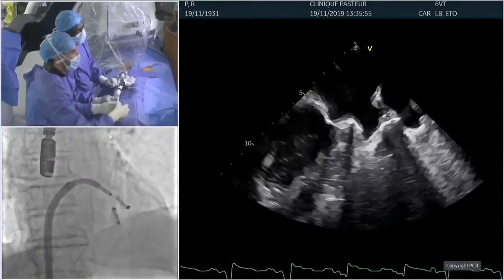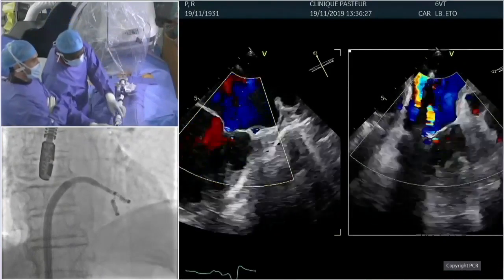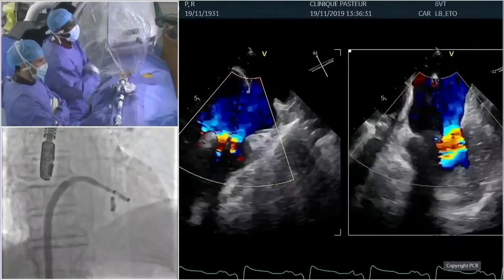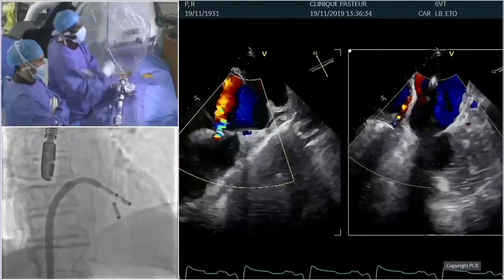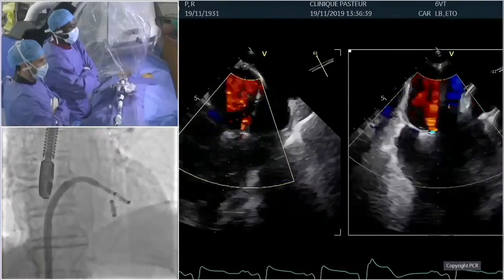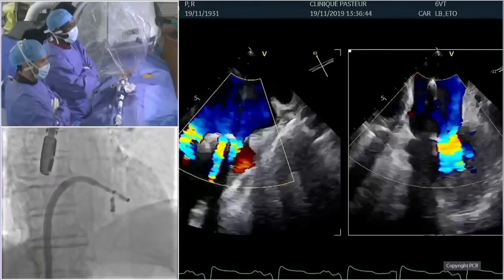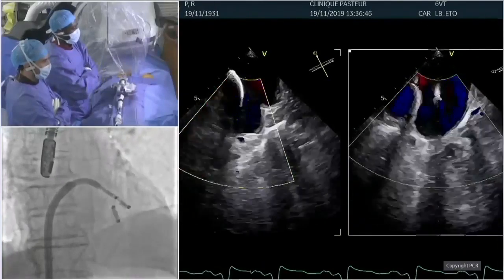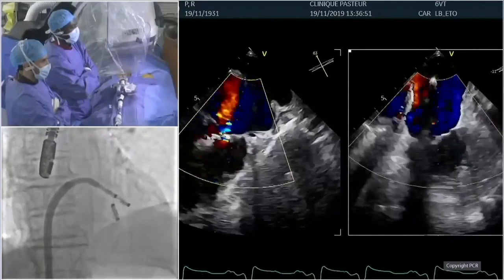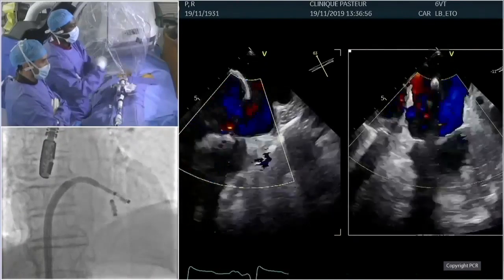Good. But there's a few questions from the panel, for the audience here. When you do this grasping, how much leaflet tissue do you ideally want to have captured? Well, yes, this is an important point. The way the leaflets are grasped and the closing mechanism of this device to be really effective, it is important that the leaflets touch the apex of the spacer. So you really should make sure that you get as much leaflet in and that the leaflet is touching the spacer. If you do so, then normally you will end up with a very good result, but that's something to make sure.